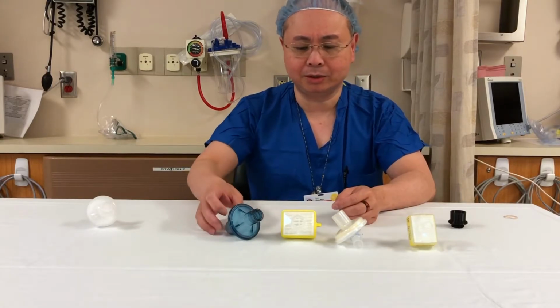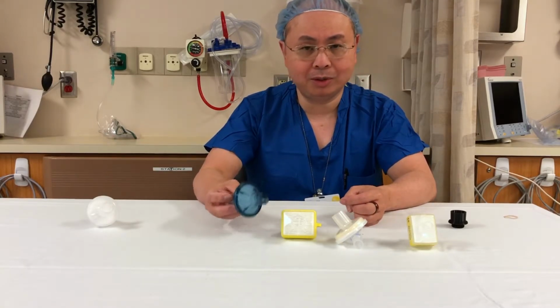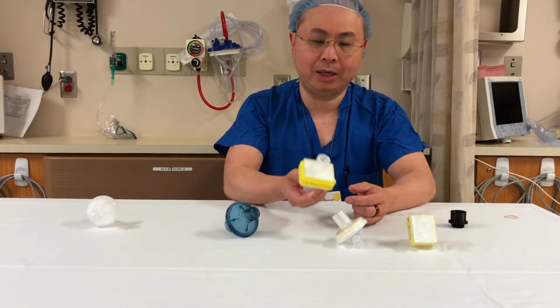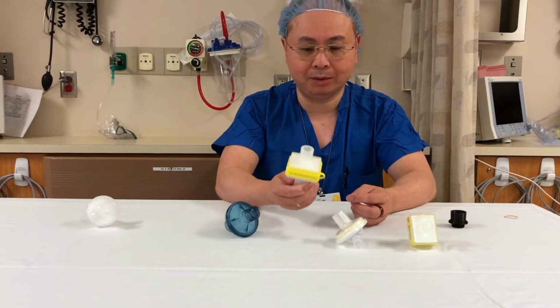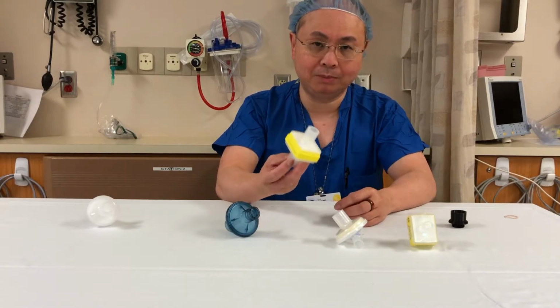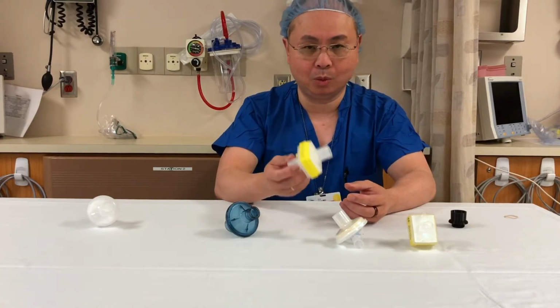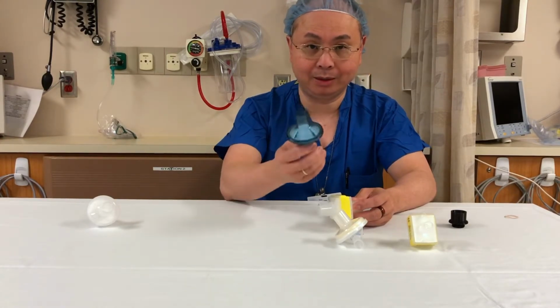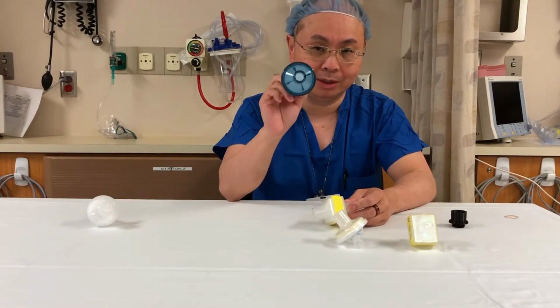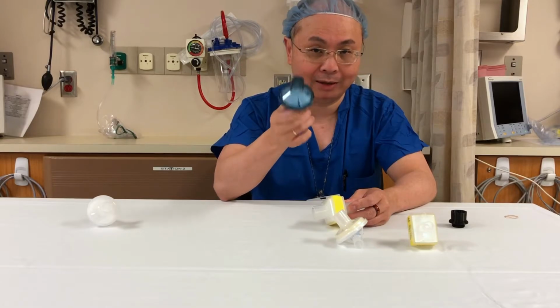Why do the anesthesia circuit filters have different shapes? Well, it's not just a matter of the mechanical fit, but they also have different functions. Some of the filters, like this Intersurgical HydroGuard Mini, also act as an HME, or heat and moisture exchange device. The reason for that is we have these hooked up to patients, and we don't want a ventilator to extract heat or moisture from the patient while we're breathing for them. On the other hand, this ViroMax filter is only a filter. It does protection against bacterial and viral contamination, but does not have an HME function.